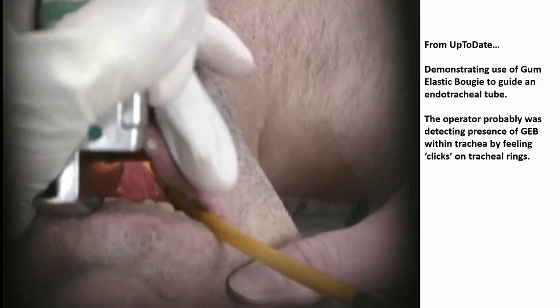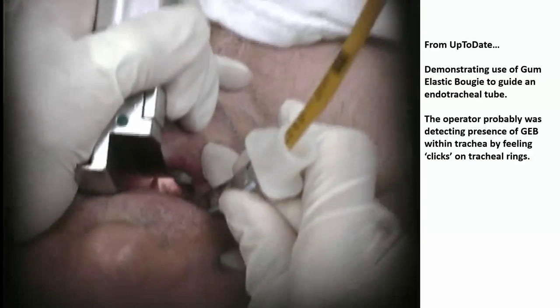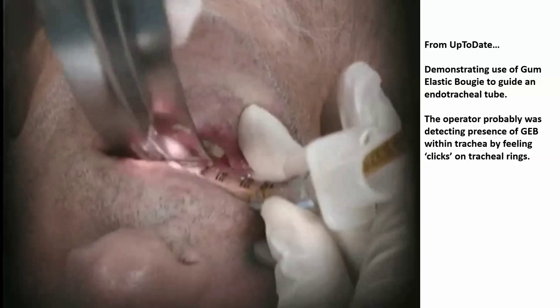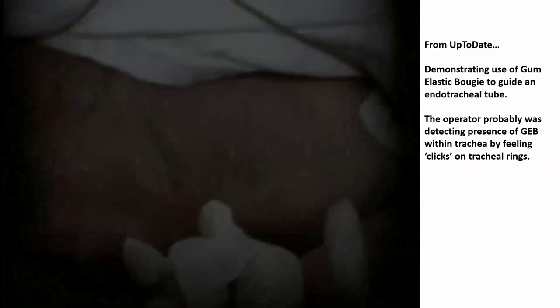This is the old-fashioned way of inserting a tube when you cannot see the laryngeal opening very well. It may well be supplanted by the use of video laryngoscopes, but if you don't have a video laryngoscope, you still have to get the tube in.